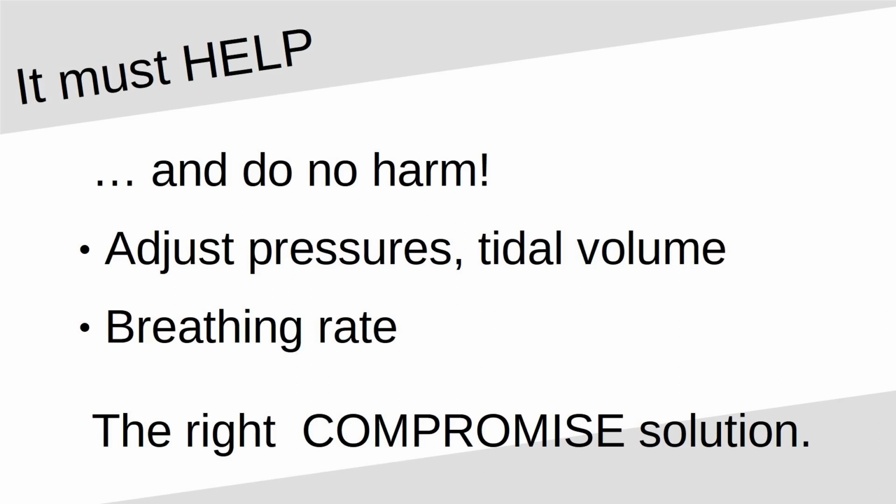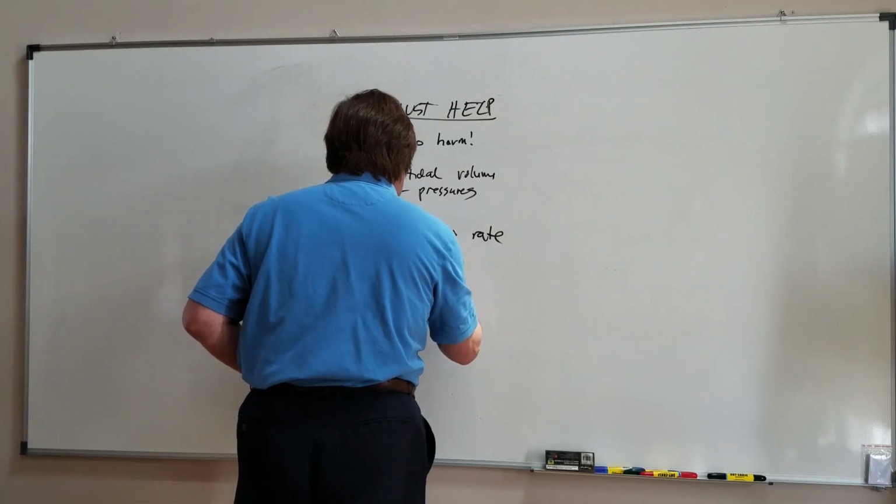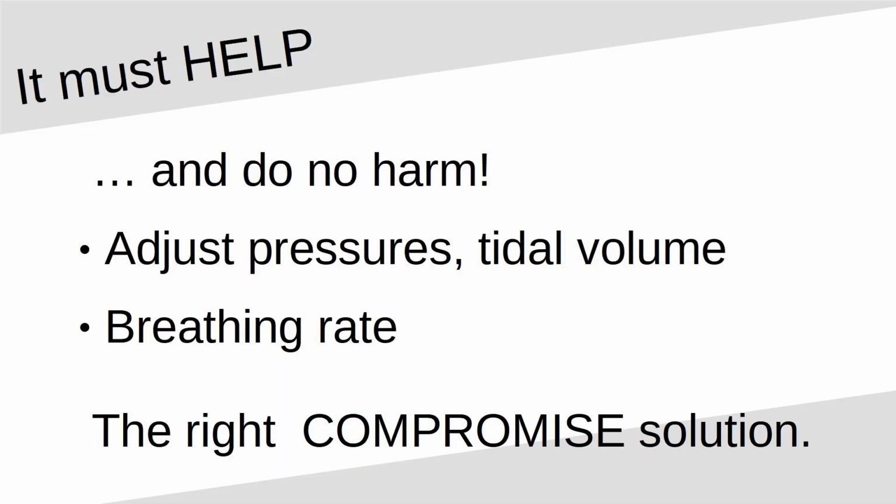That brings up a very important point about all of this. These ventilators are all very much compromised solutions. And it is very hard to get that compromise right between what's easy to build and make and reliable and good enough. There are other things that are not directly related to the pressures and volumes of air that's given to the patient, and that is the quality of the air.